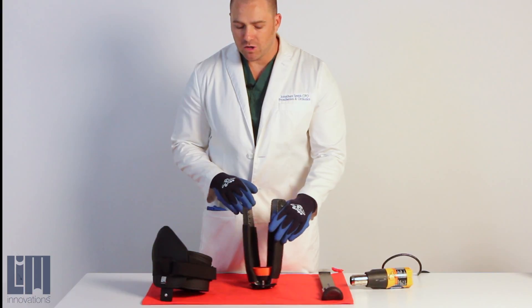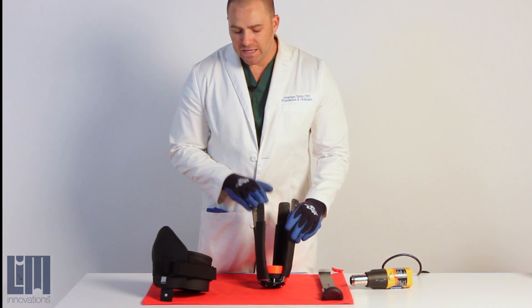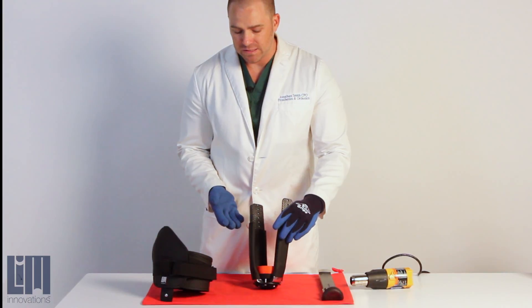The struts within the Infinite Socket are made out of a thermoformable carbon fiber. You can heat up the struts and change the surface contour over and over again — it's one of the many reasons why we call it the Infinite Socket.